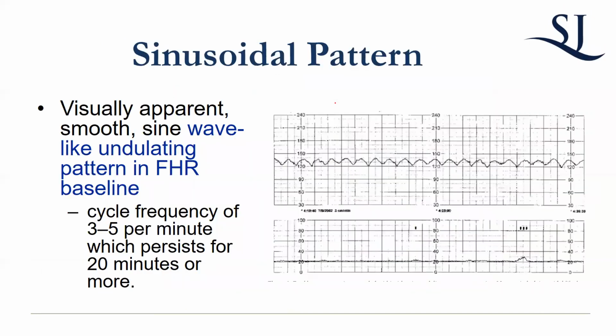So speaking of contractions, there's something called a sinusoidal pattern that they test you on a lot, but I've actually never seen, and I'm convinced isn't a real thing. But that's supposed to be indicative of fetal anemia.